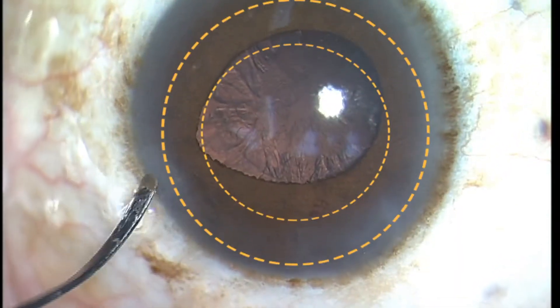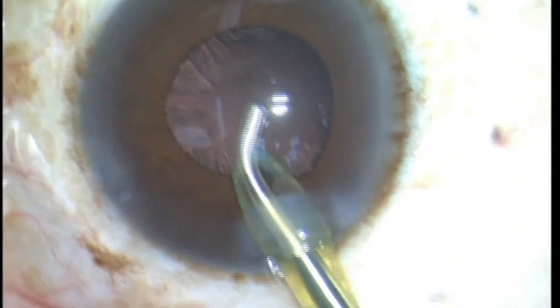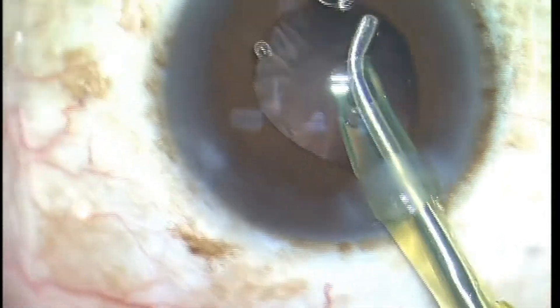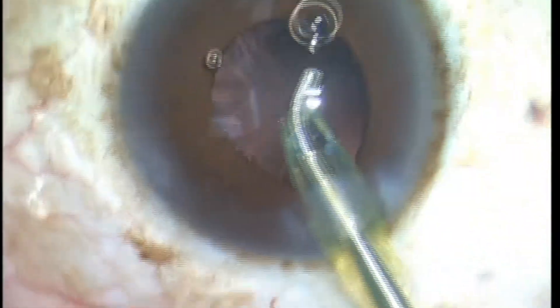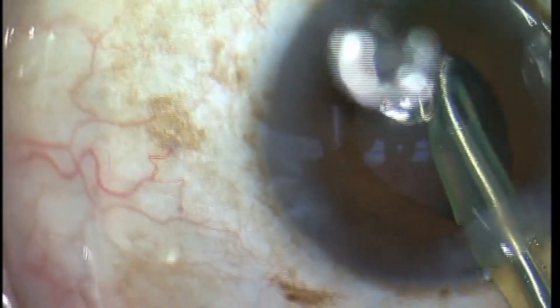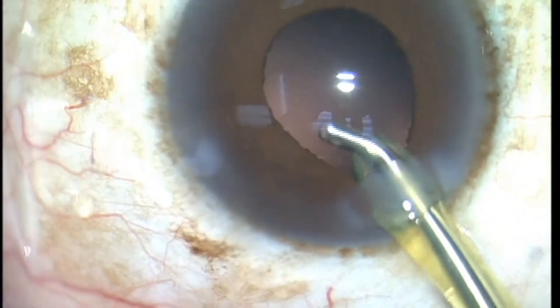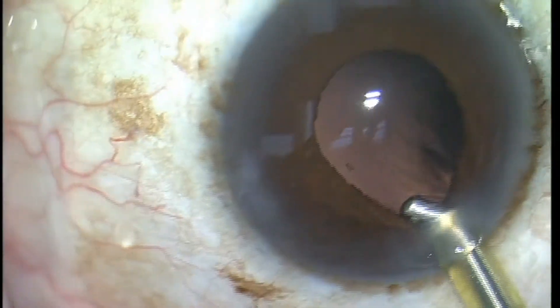Here I'm tucking the pupil back in, and you can see how much smaller the pupil has become. With about a 2.5 millimeter decrease in pupil size, you lose about 50 percent of your surgical view. The smaller the surgical view, the greater the risk of complications — things such as leaving a small piece of nuclear fragment in the eye, not being able to get all of the cortex out, not being able to see where to place the haptics of an implant, not being able to visualize the dots on a toric implant, and so forth.